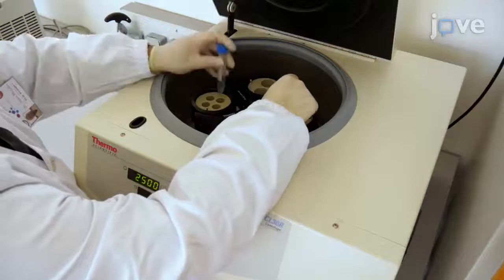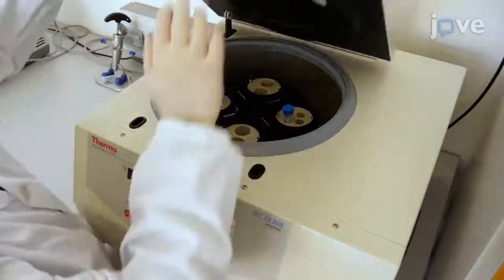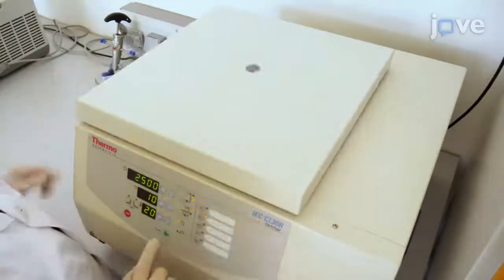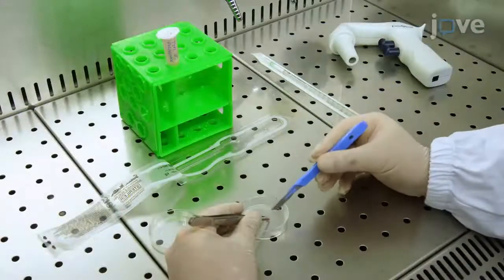Remove the Hanks solution by centrifugation at 2500 times G at room temperature for 10 minutes. Then, with a disposable scalpel, divide the pulp into approximately one millimeter slices.